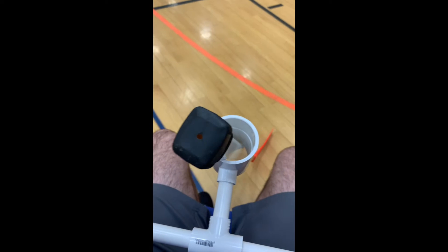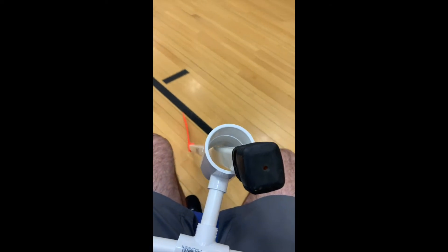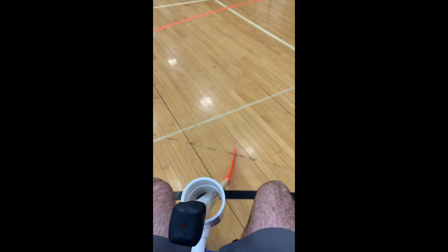Go ahead and let go of the stick and just kind of let it glide. The stick, if you're pushing yourself, would stay inside the holder while you're moving around the court.